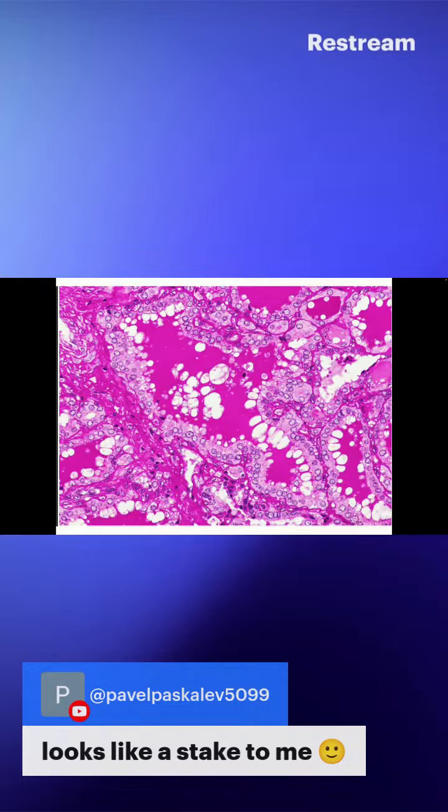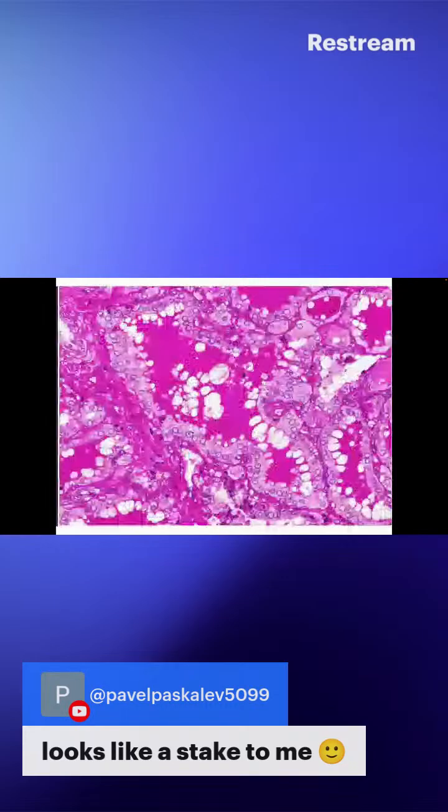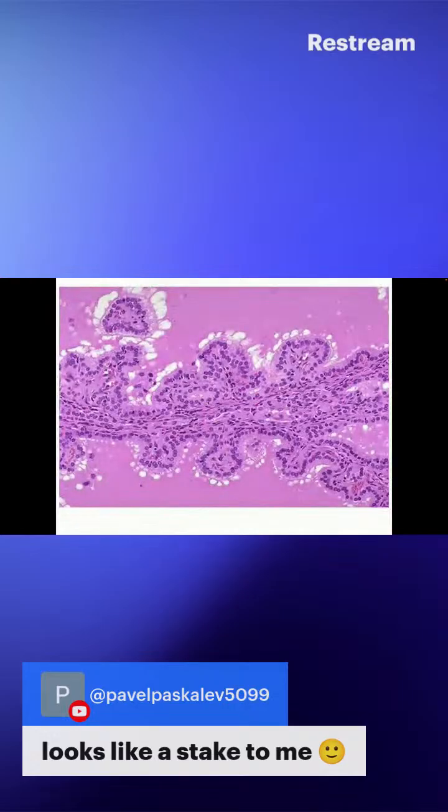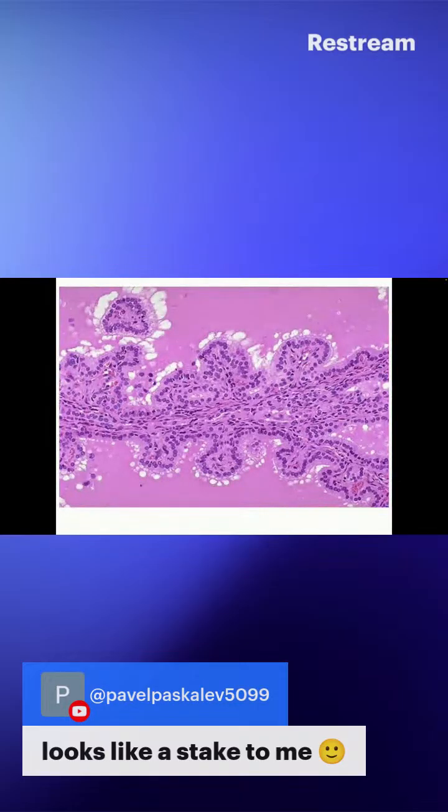And you can see here even the nucleus. It doesn't look the same as this nice, round, blue nucleus. Here, this is the exact picture of scalloping. I also have the scallop here. I don't know how to describe it, but it's ragged and not really uniform, and has this kind of scalloping appearance. And as I say, there is a papillary projection here.